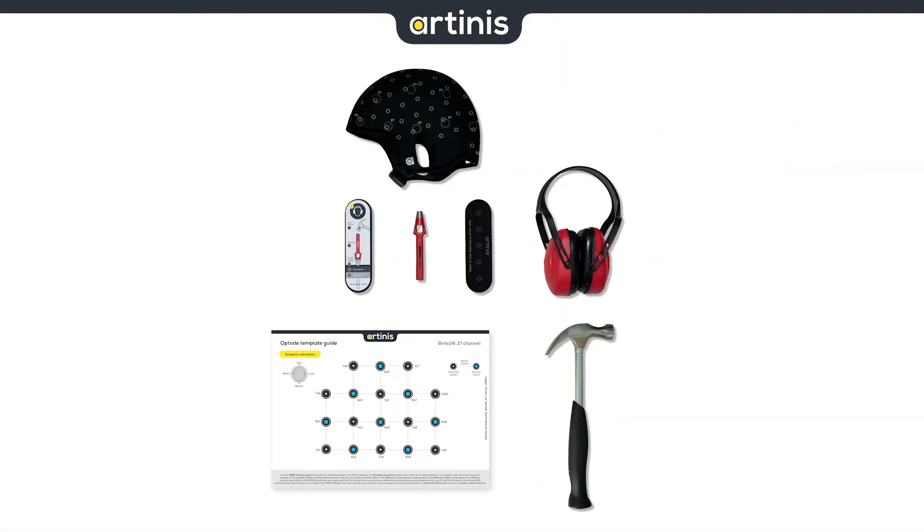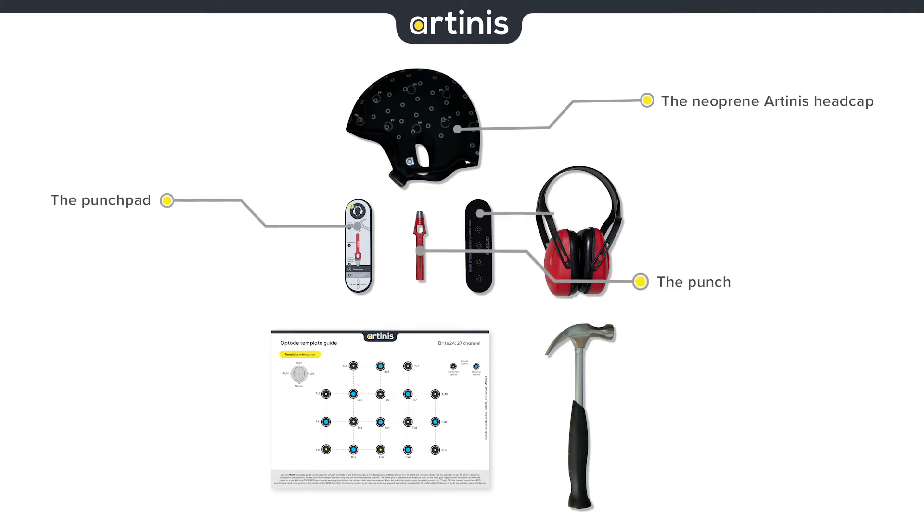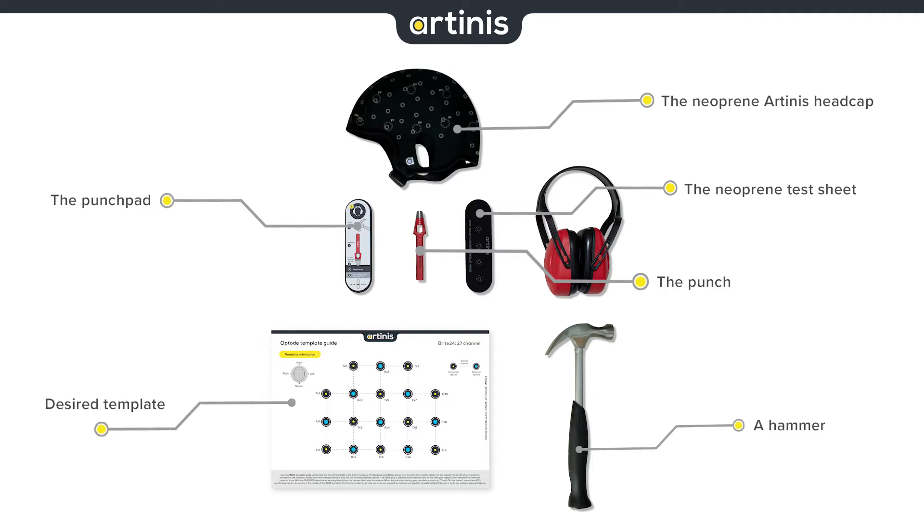In this video you will need the neoprene Artinis headcap, the punching toolkit which is included in your Artinis device purchase. It consists of a punch pad, a punch, and a neoprene test sheet to try your first punches, a hammer, and an idea of your desired template.